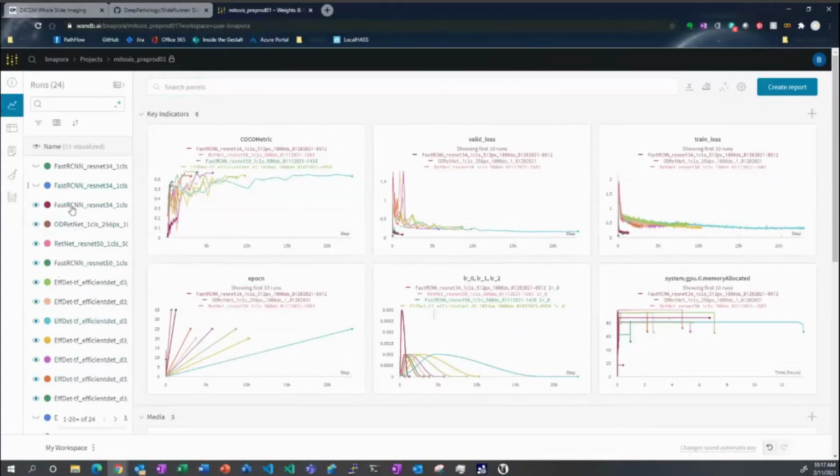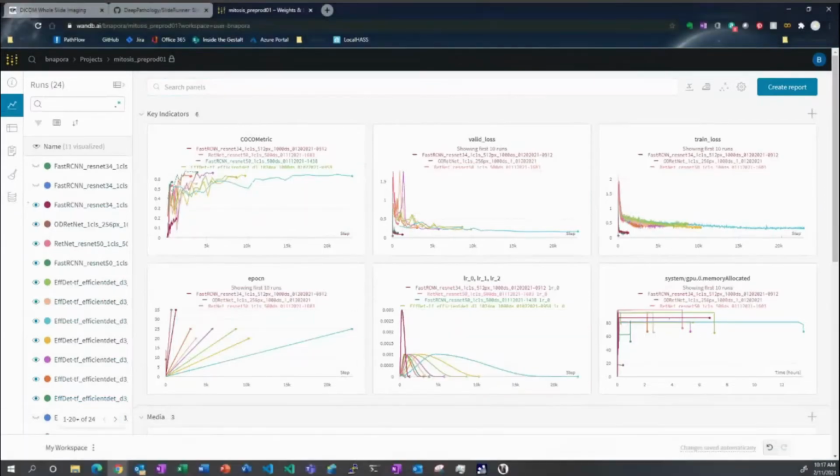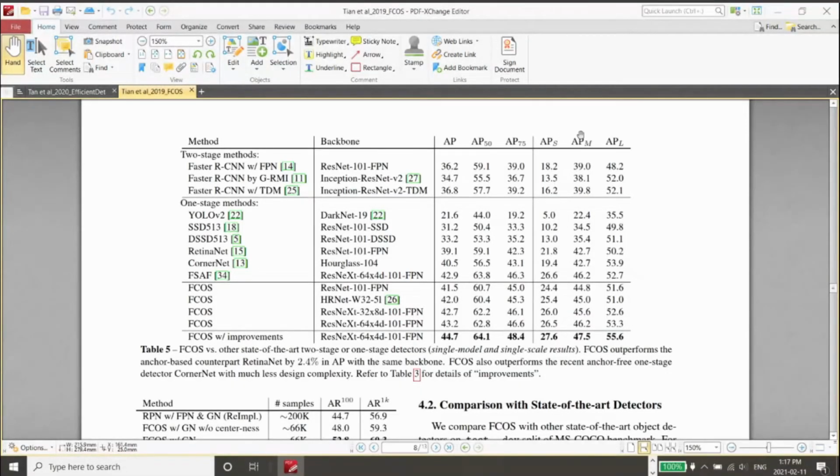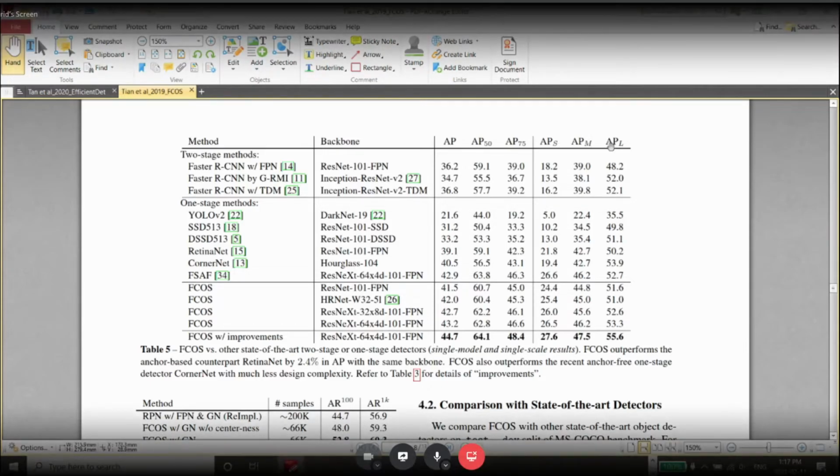But you can try doing that manually maybe, and also put a PR, because that'd be useful for everyone, I guess. Just to clarify what I was saying, I'm sharing the screen from one of the papers, and it gives an idea very quickly about the different precision for different sizes of boxes.